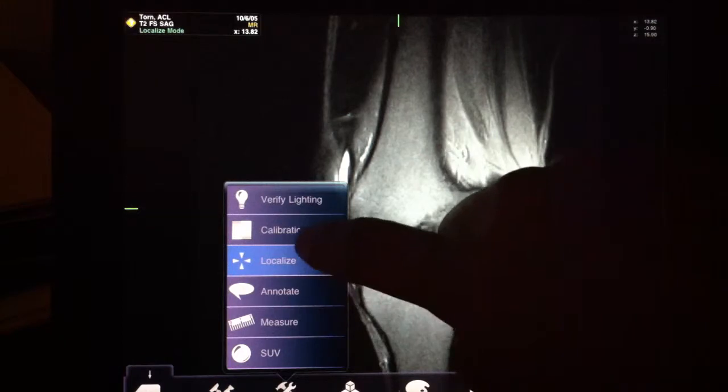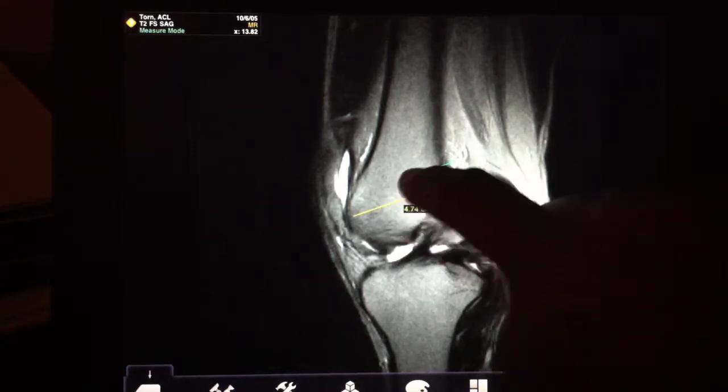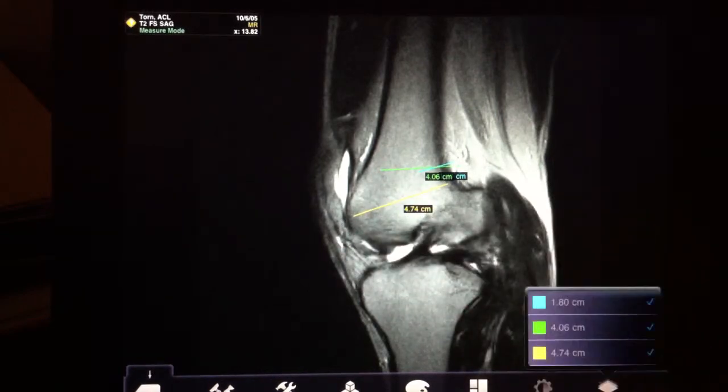The other functions available are measurement. This is performed by dragging to the first point and then dragging to the second point of interest, and then it'll draw a line. If you tap on the line again, you can make more measurements and you can see all the ones you've made.